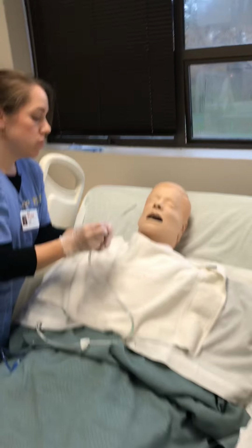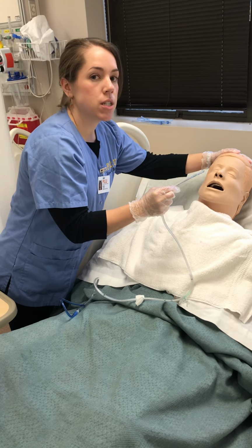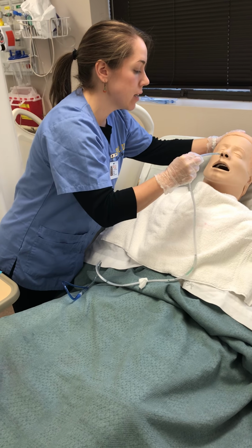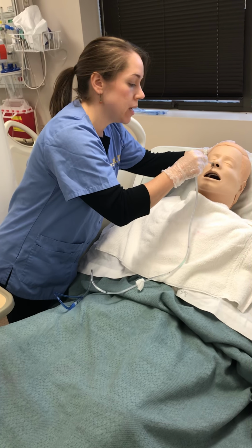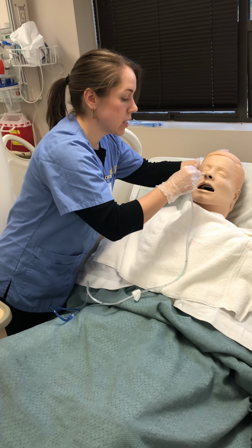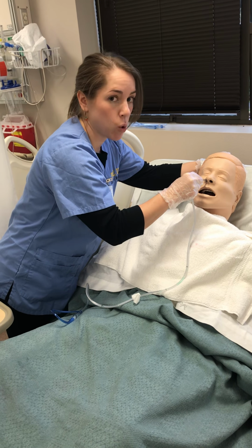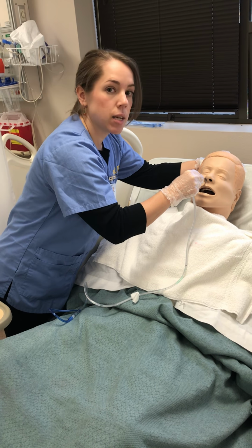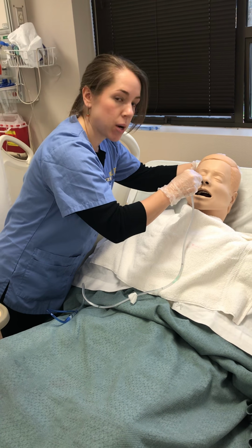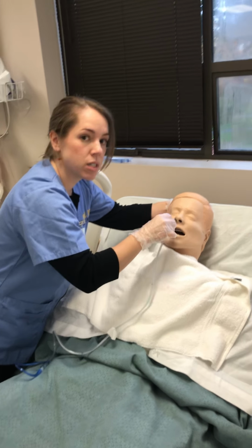And then I'm going to hold the tube about 4 inches down, and I would have the patient slightly tilt their head back, and I would push the tube in until they gag, and then pull it back out a little bit until they stop. And then if they could sip, what I would have them do is tilt their head forward a little bit, and then take a sip, and then I would push in until we get to the marked point. Since it's a dummy, I'm not going to have them tilt their head forward.